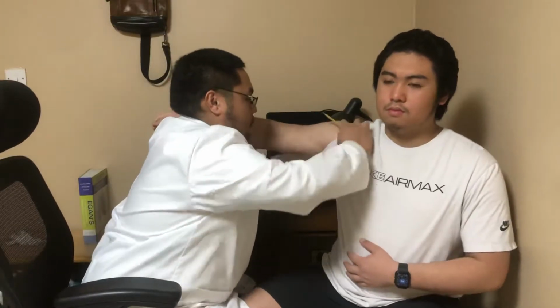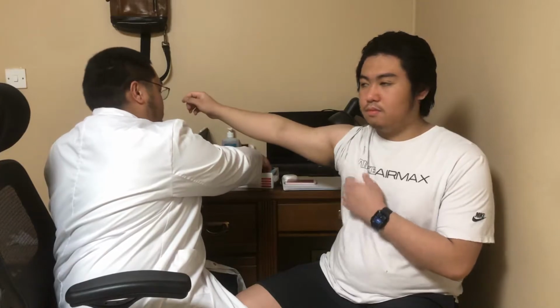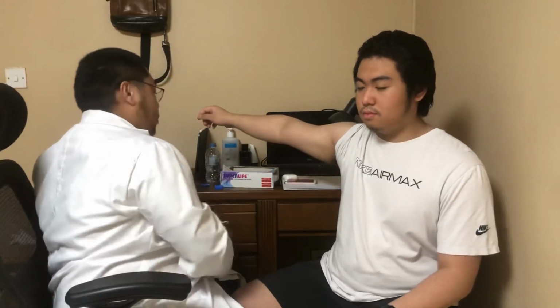So now, after cleaning it, assist the patient into exposing their shoulder and their arm. Avoid exposing the chest area as it causes discomfort to the patient. So, can I expose your shoulder and arm in order to probe it? After exposing it, make sure to pat the axillary area dry. This is to avoid any moisture that might alter the results of the final reading.